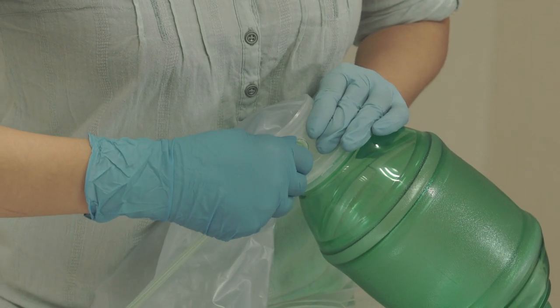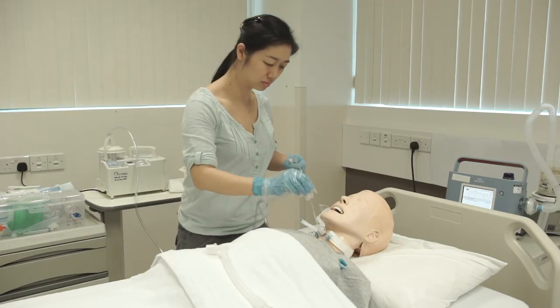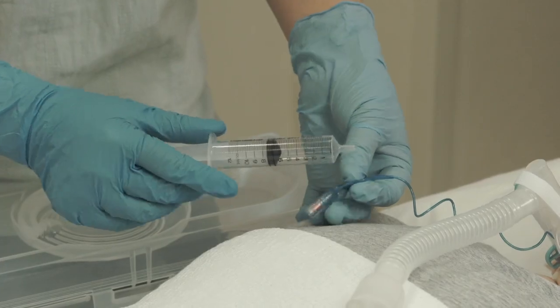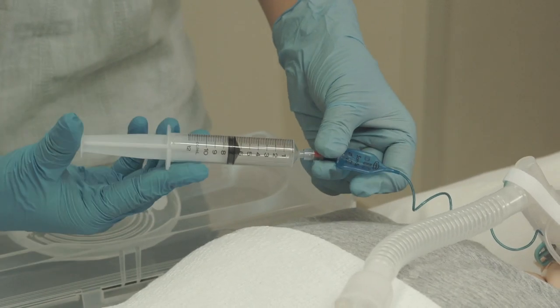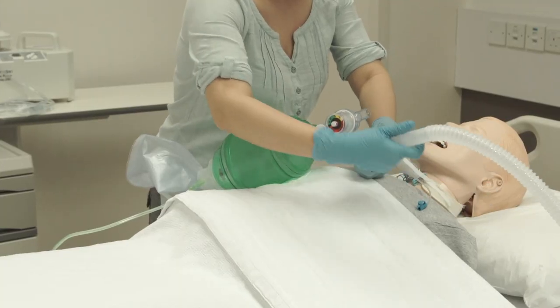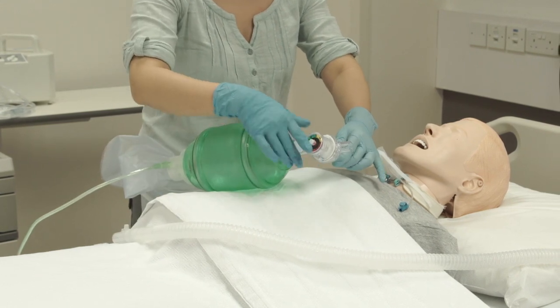Connect the Ambu Bag to the oxygen source if needed. Perform suction for the tracheostomy tube. If the patient is using a cuff tube, inflate the cuff with 6–8ml of air. Attach the Ambu Bag to the tracheostomy tube; you may use the trach adapter for easy connection.